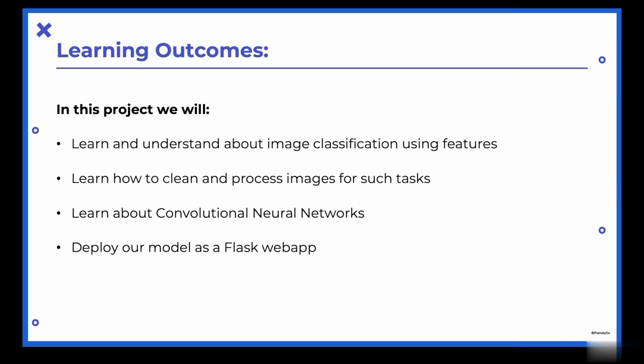We will learn and understand about image classification using features. We'll learn how to clean and process images for such tasks. We'll learn about convolutional neural networks. And finally, we'll deploy our model as a Flask web app.